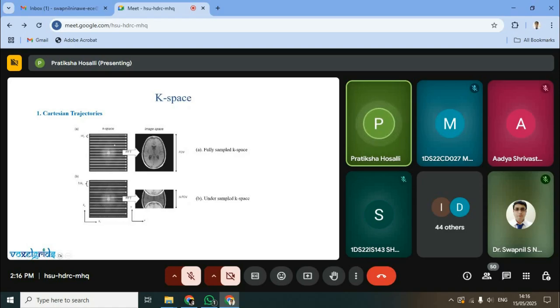I guess you people have heard about the Fourier transform? Yes. Okay, fine. If we collect the data alternatively, what will happen here? If we see here, there are artifacts because of collecting data alternatively. Okay, so I have to get this cleaned image.